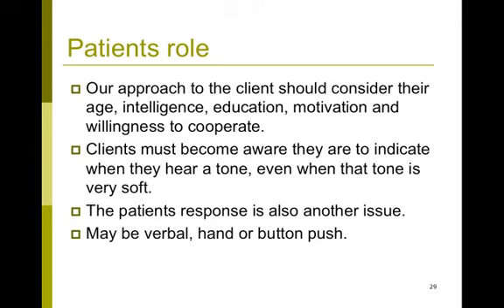Considering the patient's age and physical dexterity, you might choose different patient responses, like a hand raise or a button push. In some cases, you might ask the patient to say yes if they heard a tone, or some kind of verbal response.